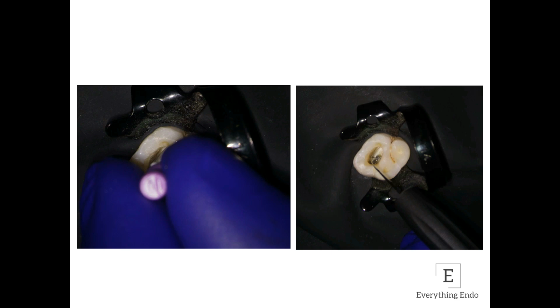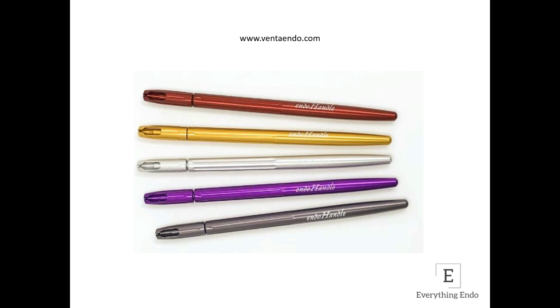The picture you're looking at here is not a micro opener but an Endo handle. This is what I use routinely in practice. The company called Venta Endo makes them. I think Zumax has one as well. The advantage of Venta Endo or these Endo handles when compared to the conventional micro openers is you can fix the conventional K files to these handles and reuse them over and over again. Though a little pricey initially, over the long run they work out very inexpensive because you can use them a number of times.